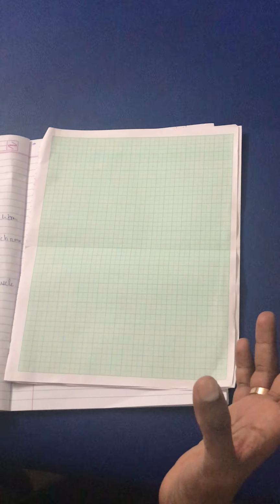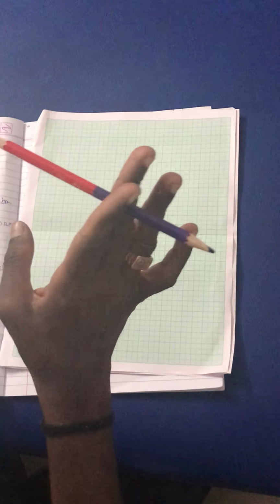So how much is there on the other side, so that I can compare with the affected side, how good or how bad the nerve is. So I can predict that. That's the very reason we want this. I'll be doing this only once at the beginning. Obviously the other side is normal, so I don't have to do it.